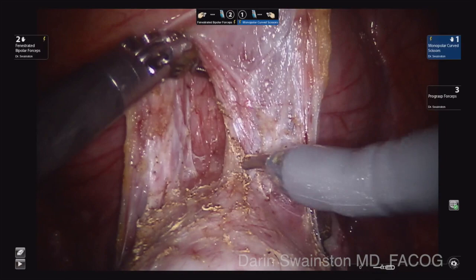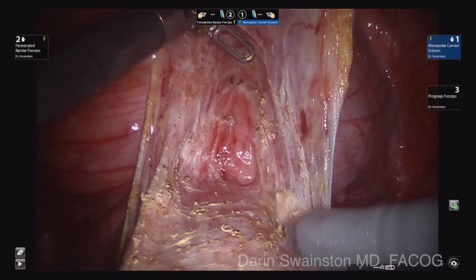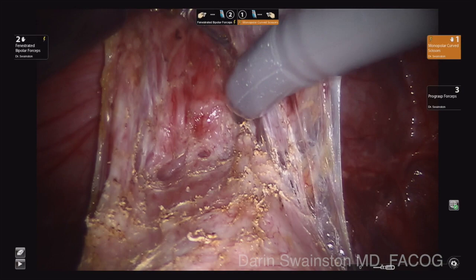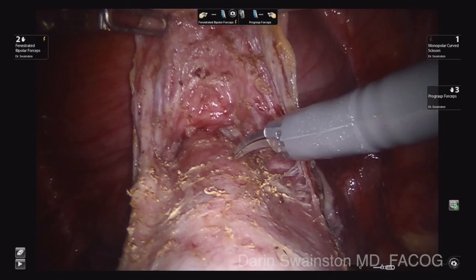I think both ways work really well. Whatever technique you use, just use good common sense. Having that bladder filled, I know I am nowhere near the bladder at this point of the dissection, so I am safe to use this technique. If I am more concerned about the tissues, I will do the push-spread technique. I love that technique on the posterior side — spreading from side to side. In here I really do not like a lot of bleeding, so I am a little more careful. Having these wristed instruments really helps.